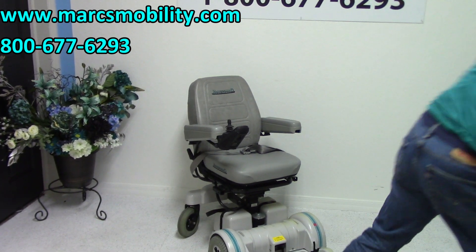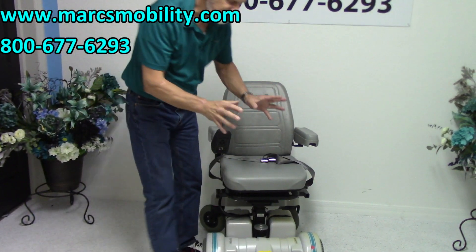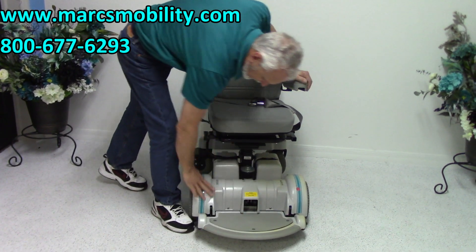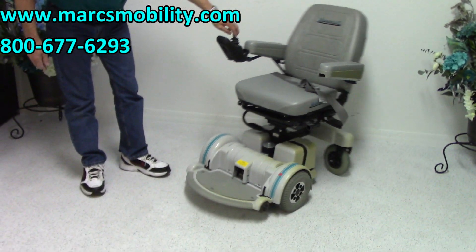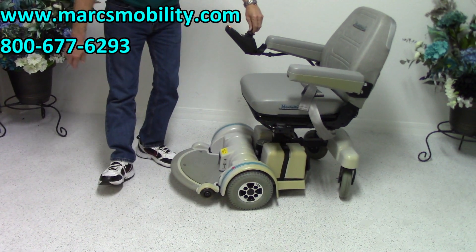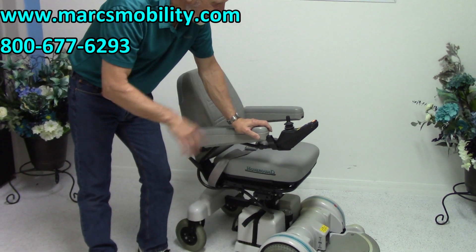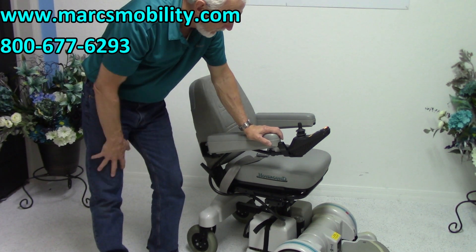The only thing I've noticed with this chair — which is in new condition — is that these Hover-Rounds, if they sit by a window inside the house and the sun hits them, it does make them yellow a little bit. You can see the yellow on the front here, but not on this side, because the sun came into the house from one direction. It's just superficial; I can't clean it, it's just the way it is. Other than that, the chair is practically new — used maybe a couple of months would be my best guess.